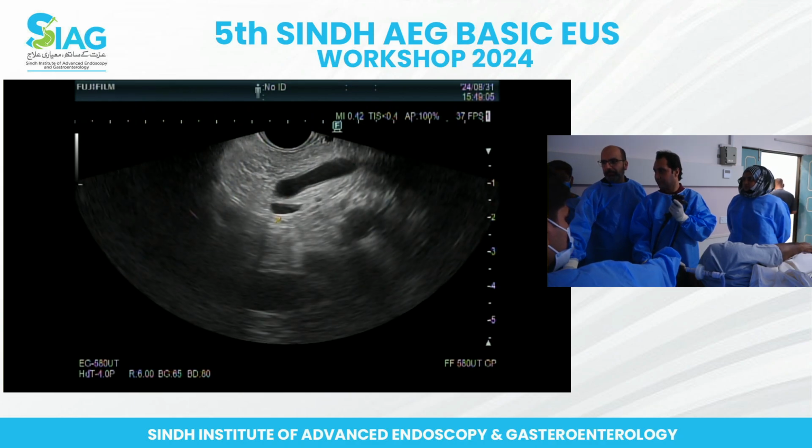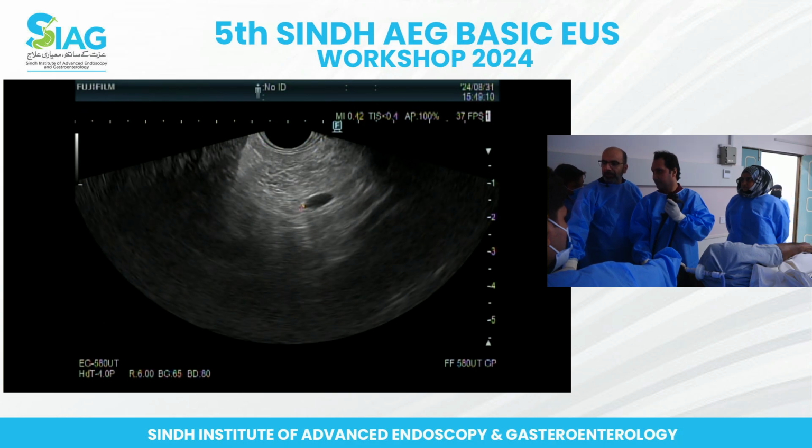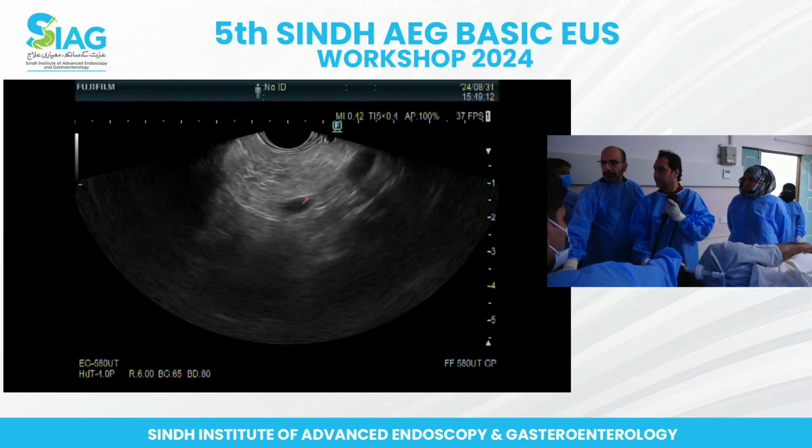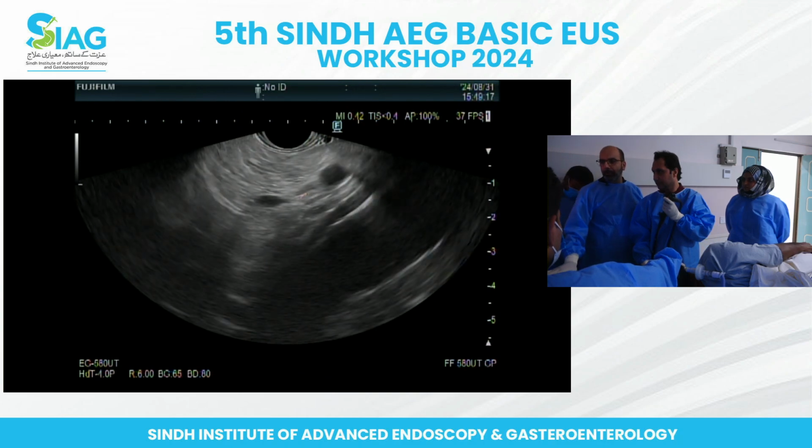That's your splenic artery, splenic vein. Yeah. So good. Keep going counterclockwise. That's it. Now you have that view that we normally look for. Yeah. So keep going. Since you've seen the tail side, now you're in the mid body. There's your duct.